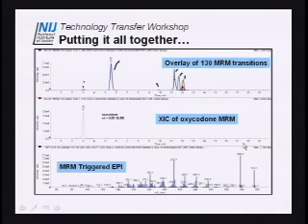If you had 130 drugs in there, it would look like a sea of colored lines. Usually there aren't more than about, I think I've probably never done more than about 20 drugs in any one case, which is really a nightmare when you think about it. You get to it and you're just so disappointed. Oh, 20. I'm going to take an hour doing mass spectra now.